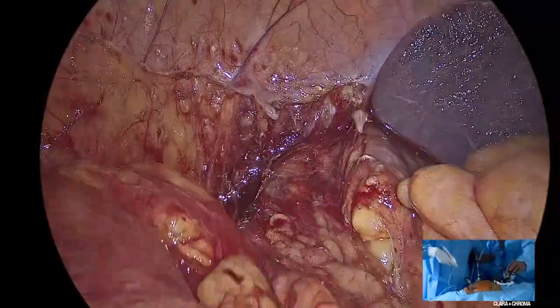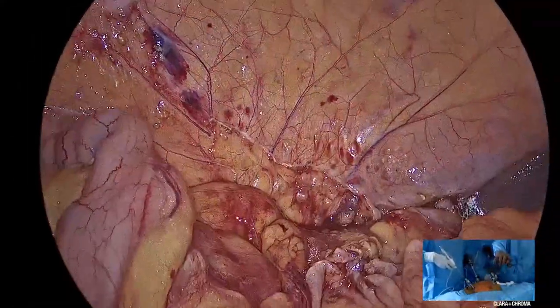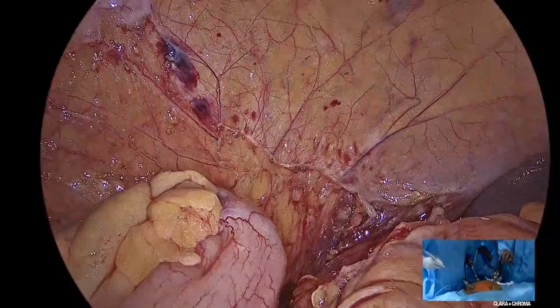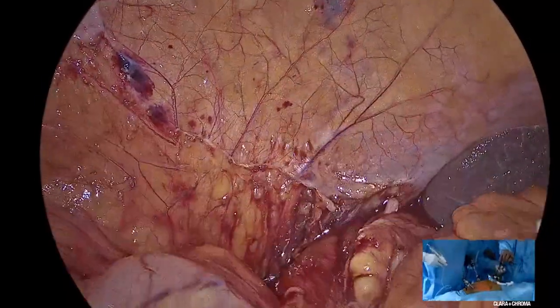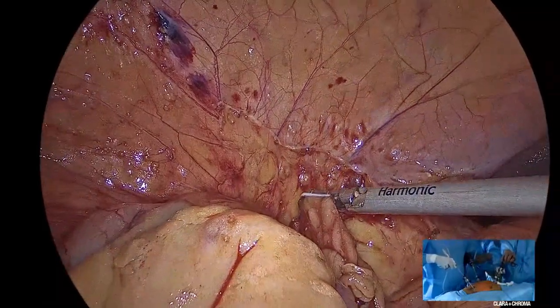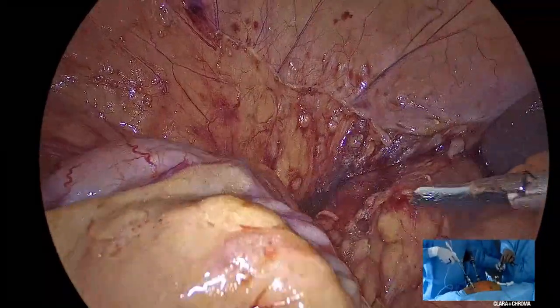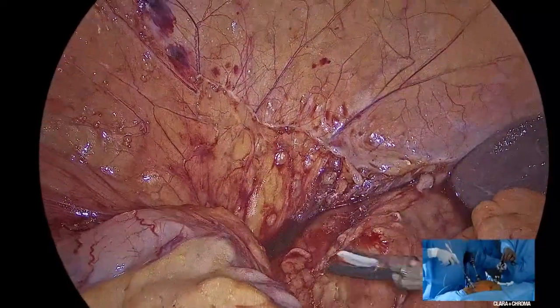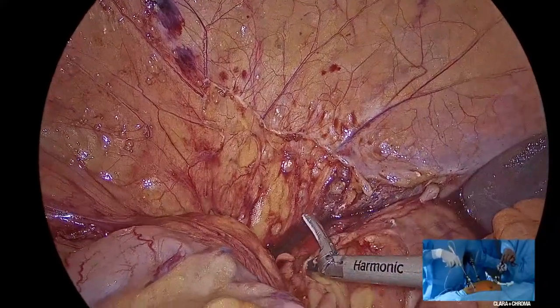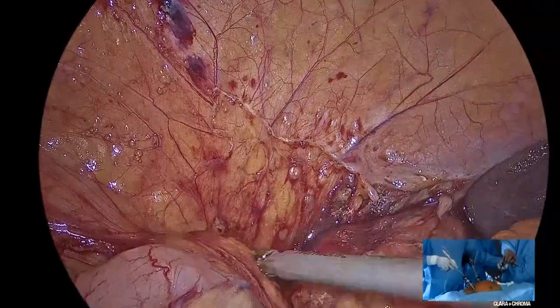Let us keep going. Do you always come to the duodenum from the lateral side, or do you prefer otherwise? No, Anil, I've had to do a lot of variation for this guy. Even my port positions have had to be tailored to the pattern of adhesions. I was just telling the audience earlier, the first 20 minutes we spent only doing adhesiolysis. Yeah, I'm sure. This guy had some kind of an ulcer operation. I'll show you in a minute. The pylorus is hooked up, attached to the left lobe of the liver, which I haven't taken down.